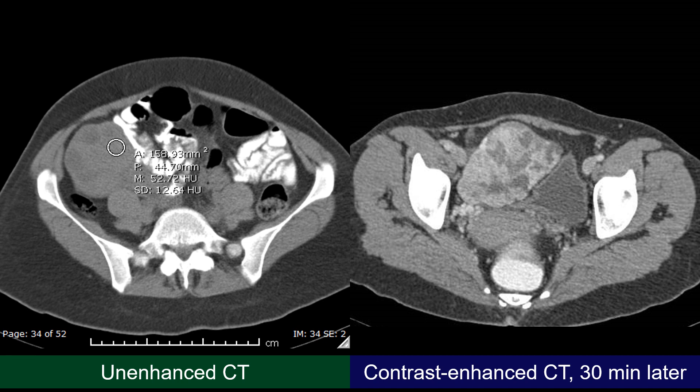The strong enhancement of the lesion on the contrast-enhanced CT is also unusual, particularly unusual for an ovary in torsion. This is probably because of the very high blood flow to the thyroid tissue within the ovary, and probably also due to uptake of iodine by the functioning thyroid tissue — not only passive enhancement of the intravascular and interstitial components, but also active uptake by the thyroid tissue.